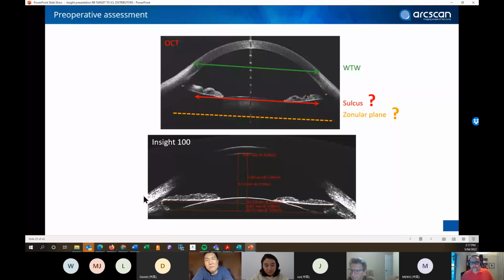These two clear lines that you can see here tell you that we were perpendicular. So this is a great image because it gives you perpendicularity, and then you know you're fine. An image without those two things is not a good image. But the focus of this image is here, and this is where we want to have focus.